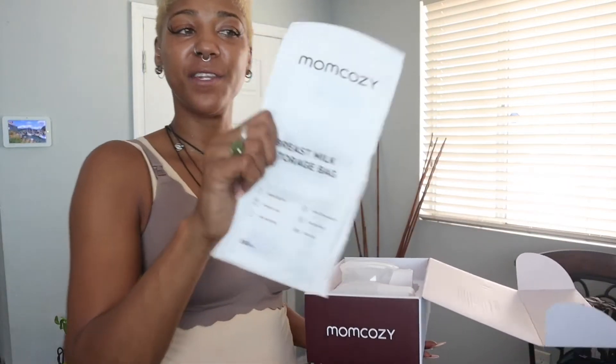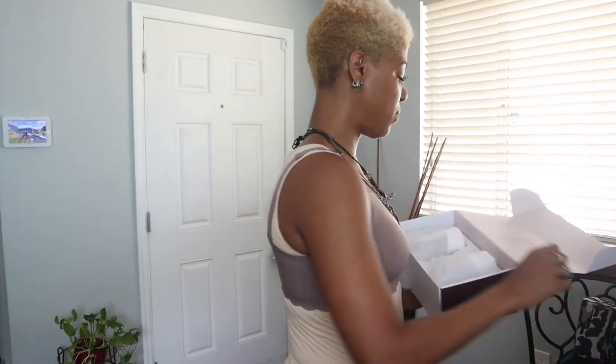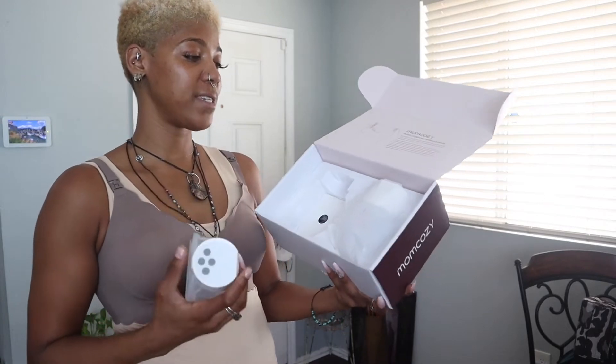You actually get a few bags in there just to hold you over before you get your main bags. These will last for months with the breast milk in them. You actually get two pumps together in this one kit for the S12.